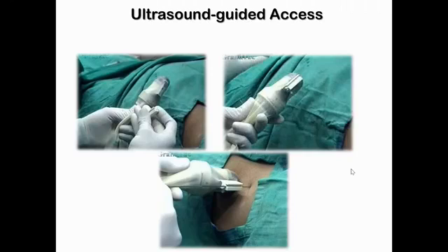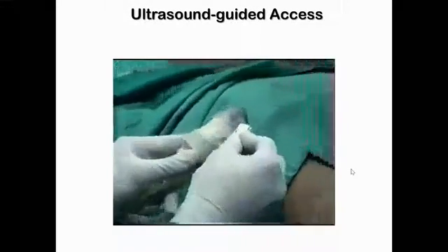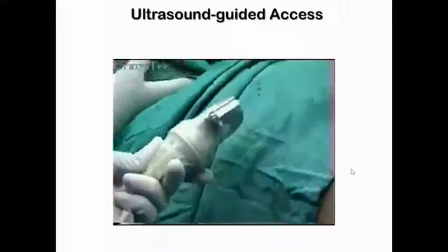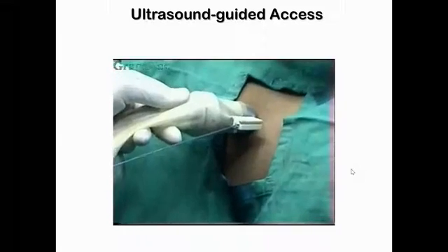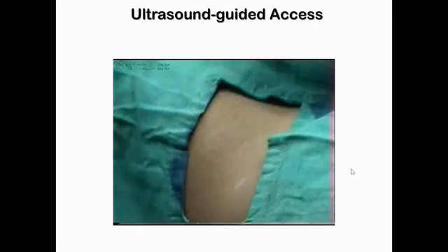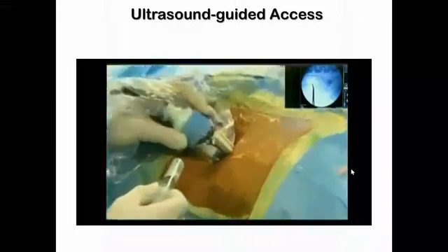So how you do this is, one of our machines has this old mechanical transducer, but it works very well because it has a small face, and you have a puncture guide which fits very well. So what you do is you cover it with a sterile cover, and you have a puncture guide attached to it, and then through the puncture guide you can pass the needle, and there is a marker line visible on the screen. So when the needle passes along the marker visible on the screen, it becomes very simple and easy for you to identify and make your puncture. So I'll just show you a short video to demonstrate how it works.